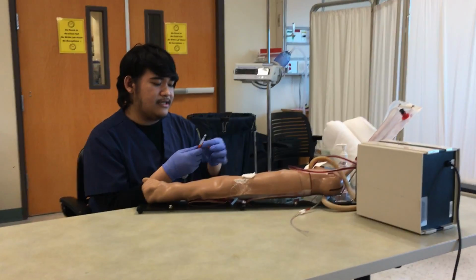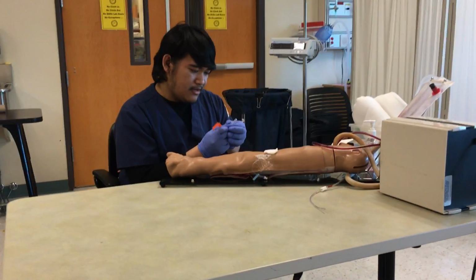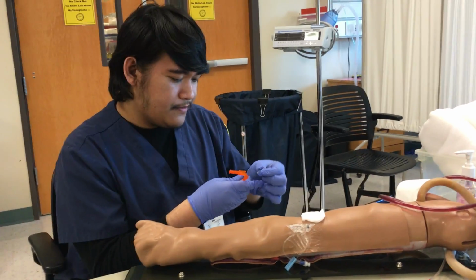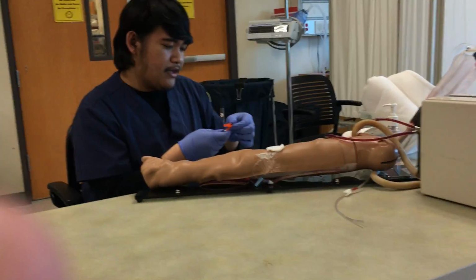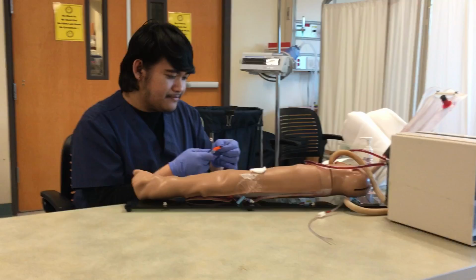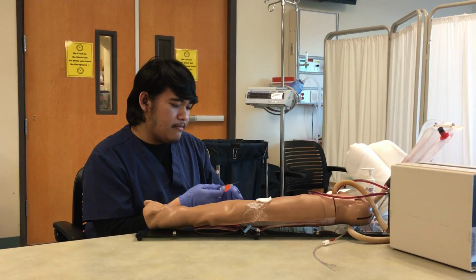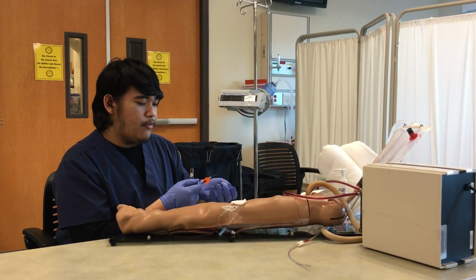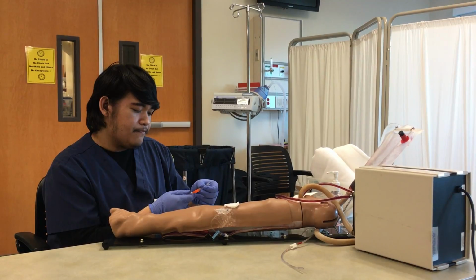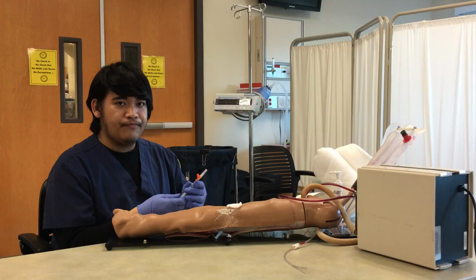Since this is a new syringe, sometimes when you take this cap off, the needle comes with it, so I'm just going to do a little fixing. Be careful with recapping this because it's a needle. You don't want to poke yourself with it. There you go. Make sure the bevel is away from the cap. That way when we do the procedure, there's no hassle.